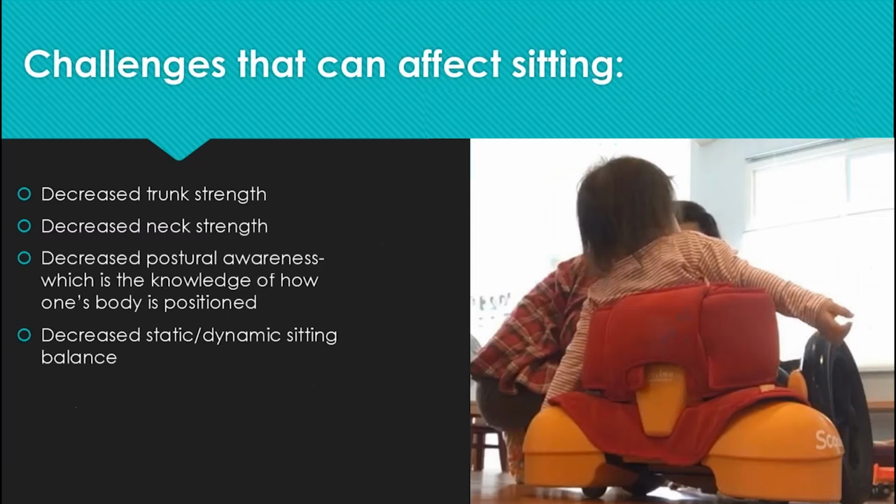Natalie, can I interject with a question from someone at this point? Would it be okay? Yes. So it's just a request to elaborate a little bit more on how much trunk control is necessary for Scooot. For example, this person's son can sit independently in a chair called a trip trap. I'm not sure if you're familiar with it. Yes, I am. But not solely on the ground without any support. Yeah, on the next slide I talk about how much strength you need to sit. On the next slide I'll elaborate about the trip trap with that too.